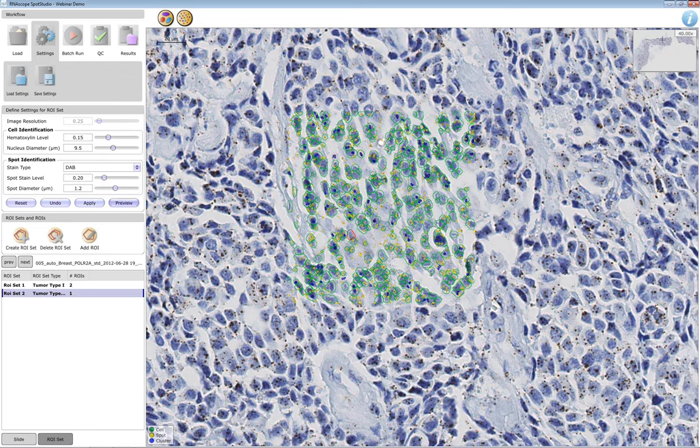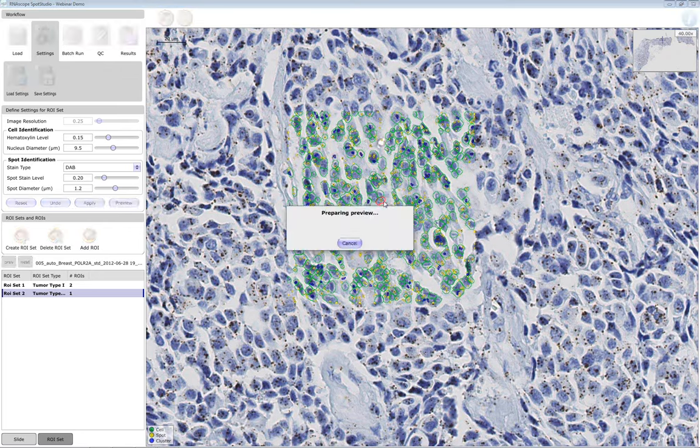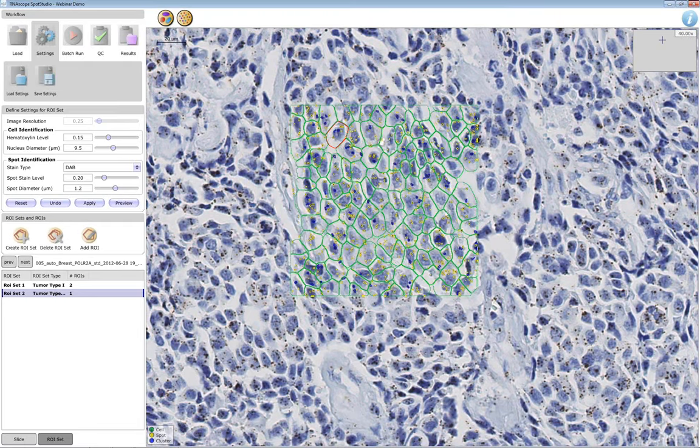This is really more dependent on the tissue type that you have and the kind of nuclei morphologies that you expect. And as I said, it's only a typical nucleus diameter, and you can see also in this picture that this picks up pretty small nuclei here and pretty large nuclei here, and an even larger one here, pretty well. So with one setting you cover a full range of different nuclei of one particular tissue type.